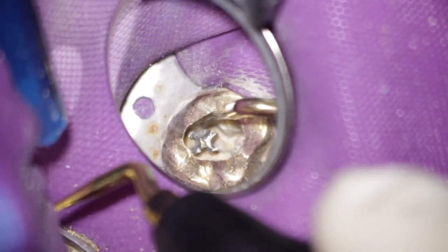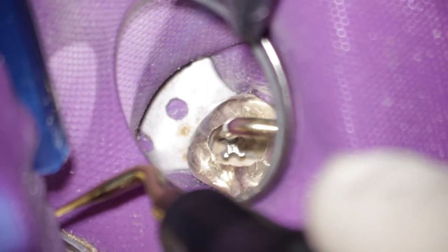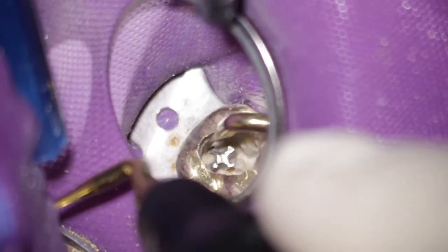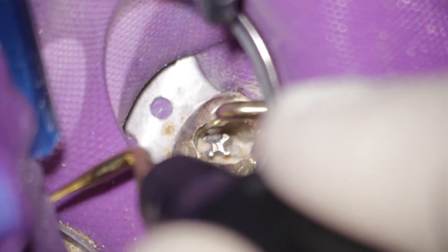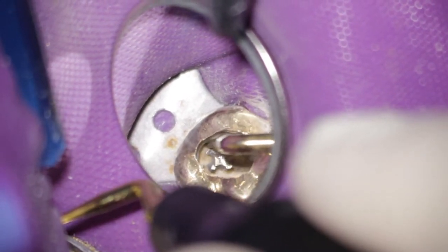You can see how I specifically remove, step after step, the cement out of the gap between the post and the canal, always trying to remove no sound dentine and always trying to be as near to the post as possible. If you try to move the post out now, you will fail, because it is cemented so solidly that it doesn't move a tiny little bit.